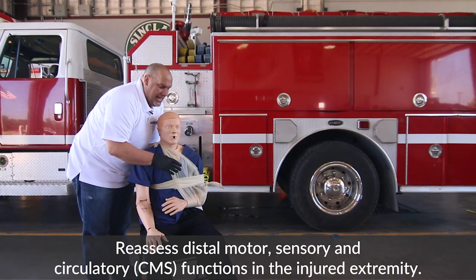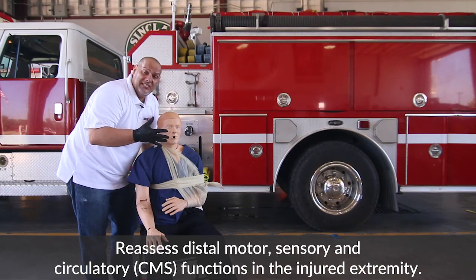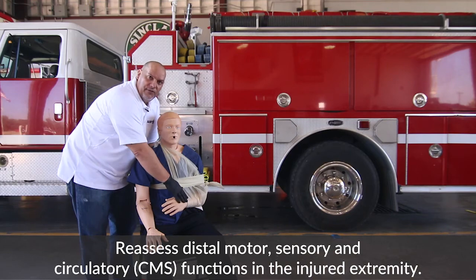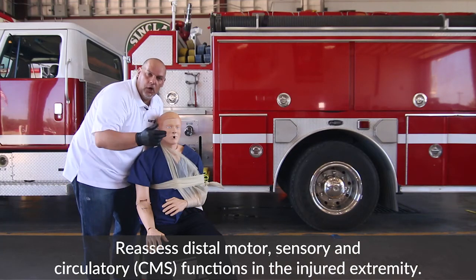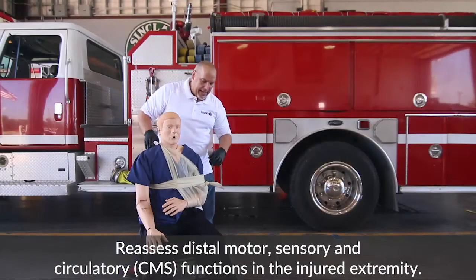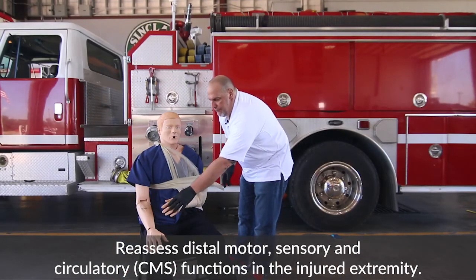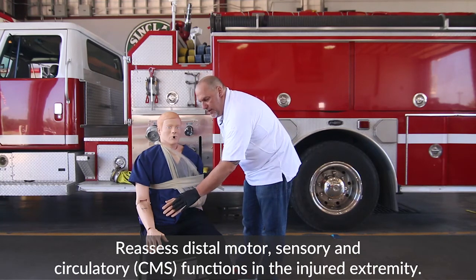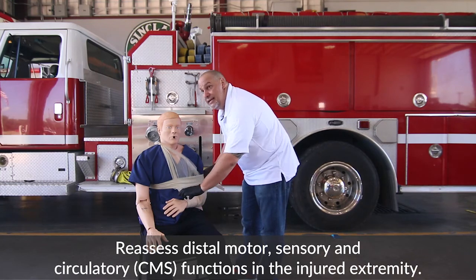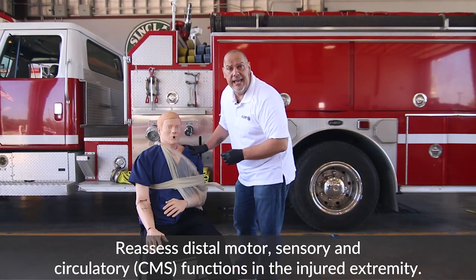If we go back to the patient and they've lost their pulses, lost motor function, or lost sensory feeling, we know that we've done a bad job with our bandaging — we need to take it all off and start all over again. So as we come back, we're going to check: 'Let me know when you feel me touching you. Wiggle your fingers, sir.' Check for pulses. At this time, your examiner is going to let you know that CMS is present and normal.